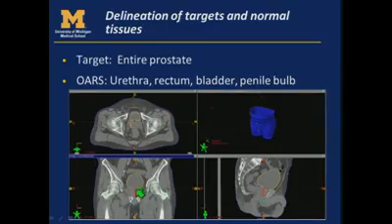but it pretty much goes midline if you're looking at the coronal, but it takes a turn, and it takes a very highly variable turn from patient to patient, connecting the bladder to the outside world. And it could be much more crooked or it could be straighter. And so that's why it's really important to know exactly where it is for each patient to know what you're going to be sparing. And then the penile bulb below here as well is important, we think, for sexual function.